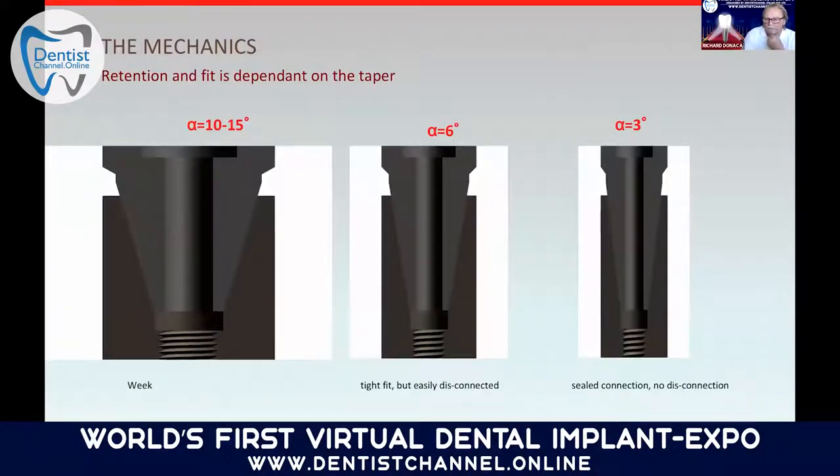The mechanics of the taper is actually that anything over 10 to 15 degrees is a weak conical connection. The 6 degree is a tight fit, but is easily disconnected. That's 6 degrees on each side, so 12 degrees in total. And a 3 degree connection, so let's say 1.5 or 3 degrees on each side, is a sealed connection with no disconnection without a special tool that helps you to remove or release the abutment and implant connection.